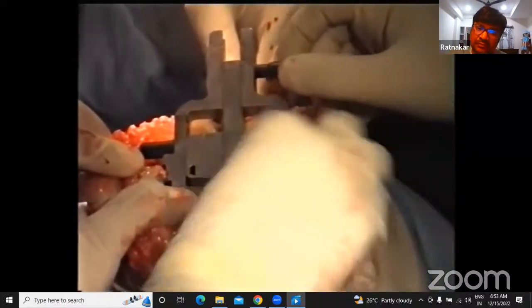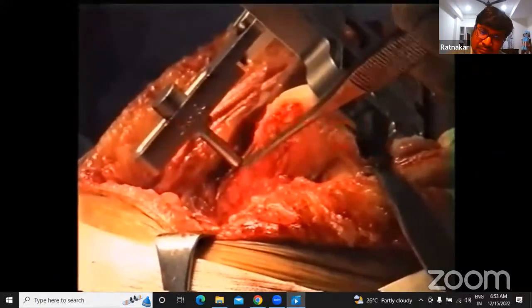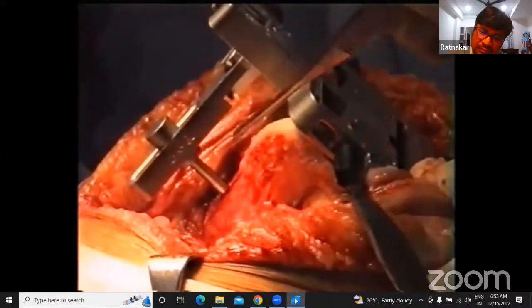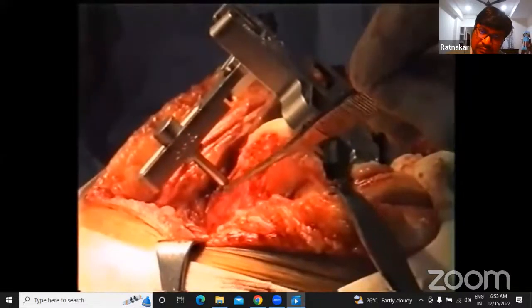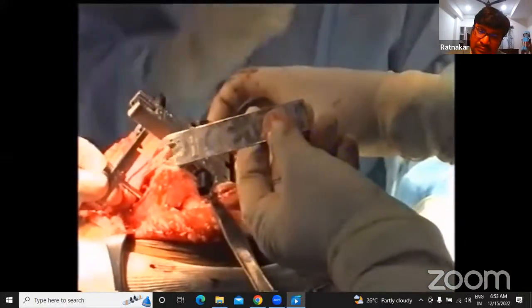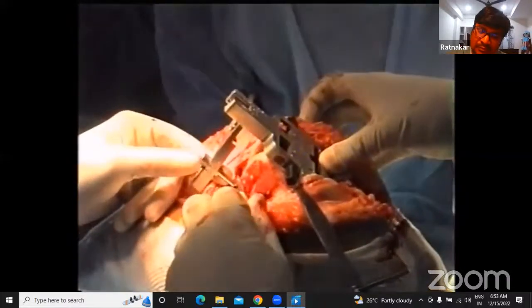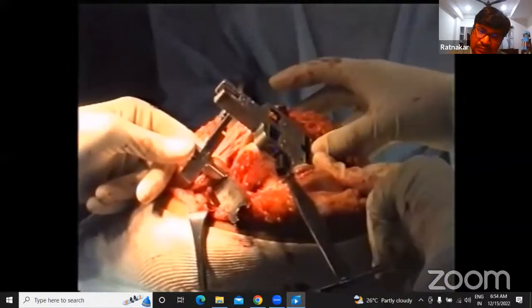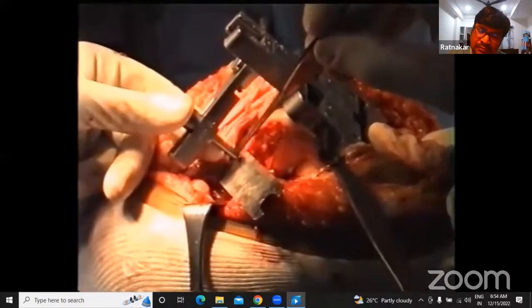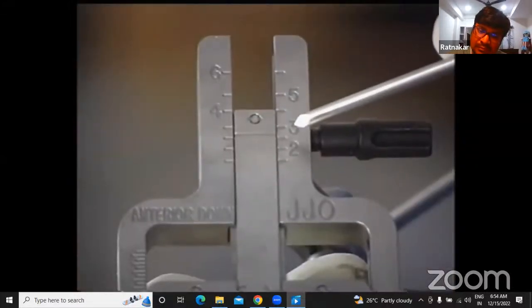Here, a very important point is you should never notch the anterior femoral cortex, and that is our stylus. This should touch the lateral most prominent part of the anterior femoral cortex. Otherwise, if you go into the central or medial part, you will end up notching, because this is the most prominent part. One practical tip to avoid notching is to use a blade, put it on the anterior femoral cortex, and take the measurement on the top. Then that means you are just 2 millimeters on the top. By putting this blade, I'm referring to the anterior femoral cortex 2 millimeters above, so there will never be a notching. Now let us see the sizing.